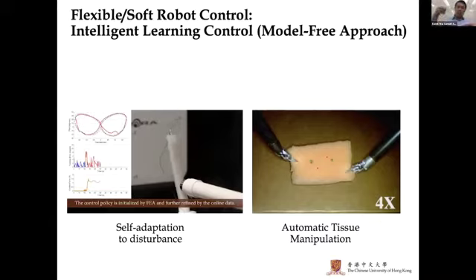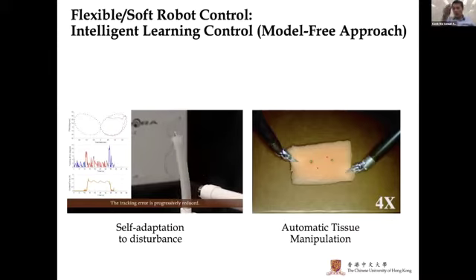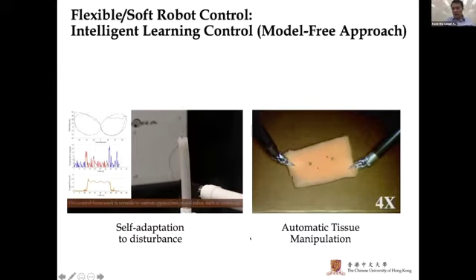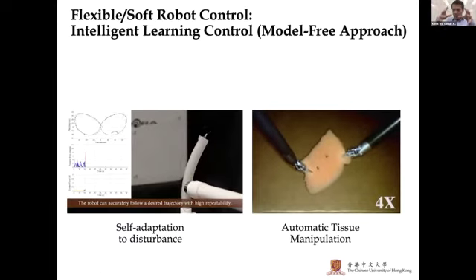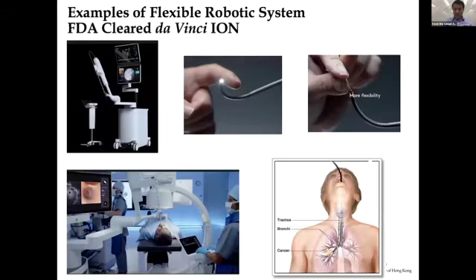You can imagine when you put an endoscope inside a robot, the tissue will push against the robot, and a lot of the time your control may not be able to maintain a certain pointing direction. But with this control algorithm, we can always maintain the pointing direction even though you're pushing against the skin or tissue. And this is another example using purely autonomous control, looking at the image, where we can autonomously control the so-called DVRK, the da Vinci Research Kit, so that we can manipulate soft tissue at any location.